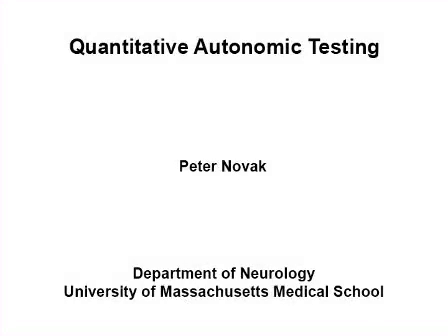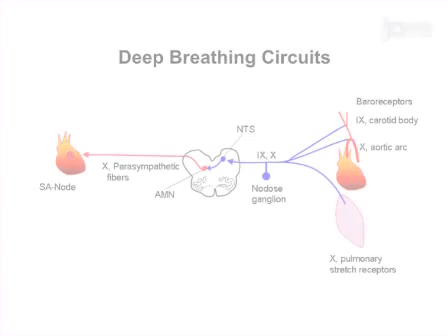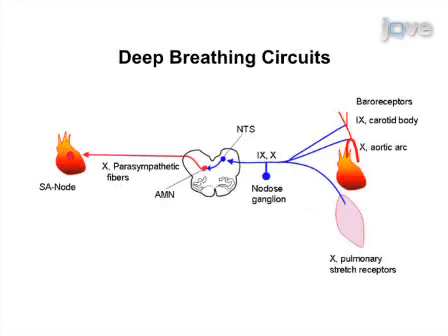The overall goal of this procedure is to describe standardized quantitative testing of autonomic functions. The presented protocol evaluates all three major autonomic domains: cardiovagal, adrenergic, and sudomotor. Finally, the severity and distribution of dysautonomia is quantitated using Composite Autonomic Severity Scores. Several assessments are used to accomplish this.